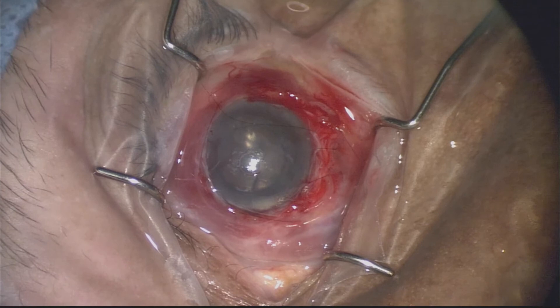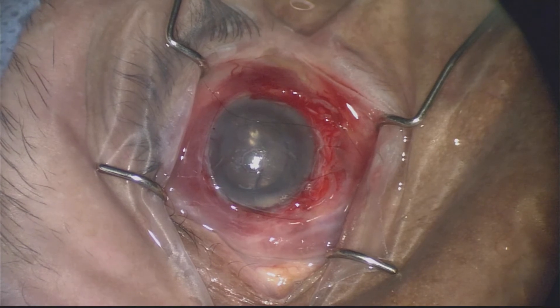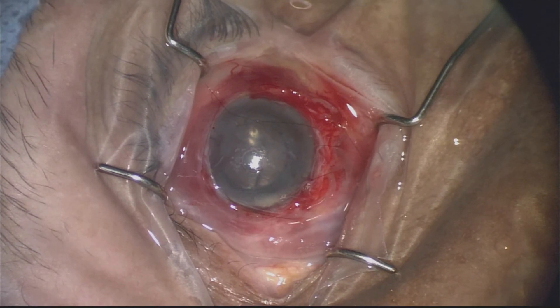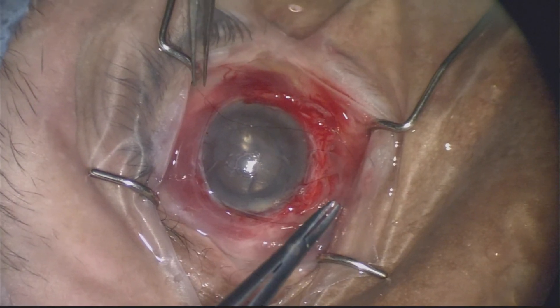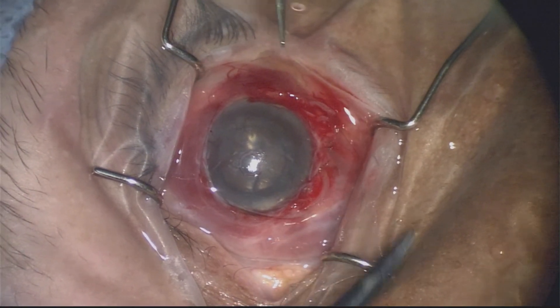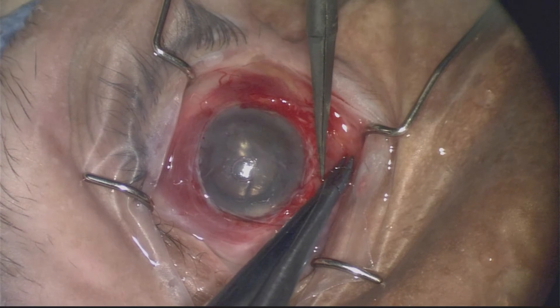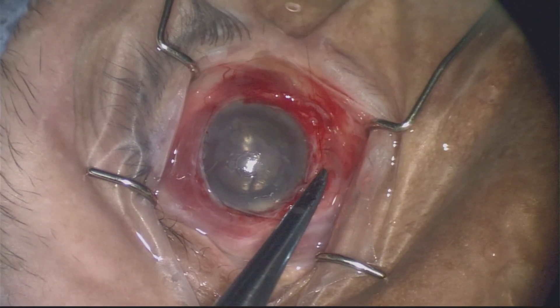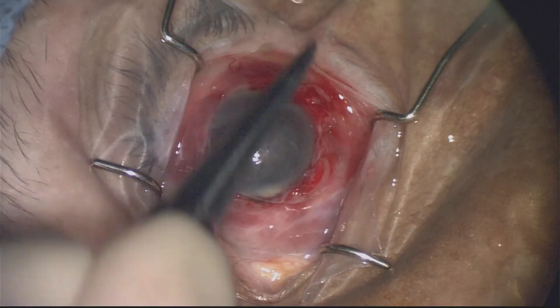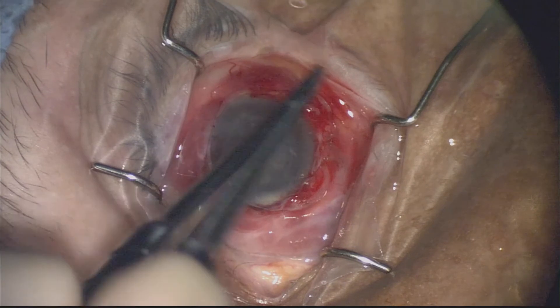Now I've moved on to putting the amniotic membrane on — I've already put one layer of amnion on and extended it out to the periphery underneath the conjunctiva where the peritomy is. I'm using a continuous suture to hold the amnion in place. It wouldn't be a bad idea to put a double layer on, and to suture the conjunctiva in a better position using 10-0 nylon incorporating it into the amnion.